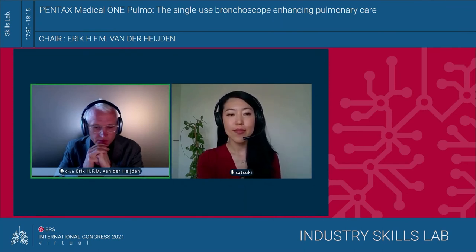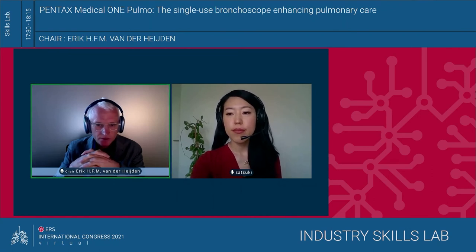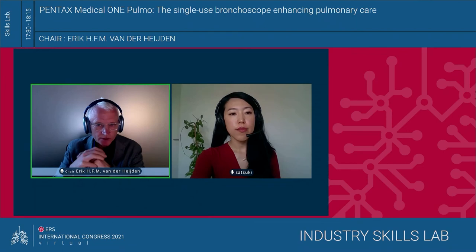Since COVID-19, we've become aware of the risk for our co-workers who are involved in the cleaning of the bronchoscope. So since COVID has come around, we have started using single-use bronchoscopes for all the lavages we need to do on the ICU, and we'll continue to do so in patients who are of risk to us due to their virus load. But I think we need to expand it also to patients who are having immune deficiency.